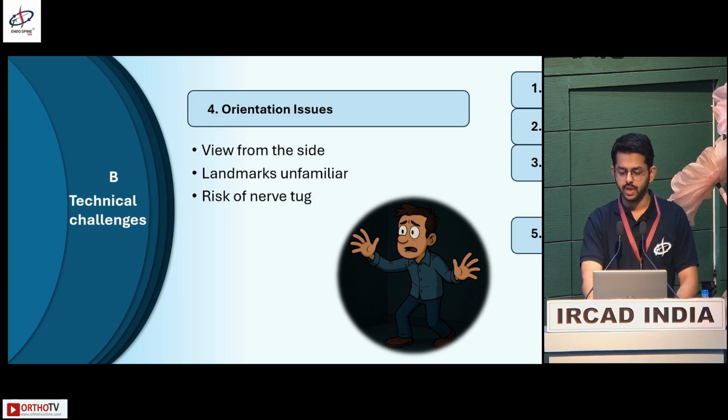Endoscopic views are magnified but distorted, especially in transforaminal cases where you are viewing anatomy from the side. It is easy to misjudge the depth or angles, especially when navigating around the root or fragments. This misjudgment can result in unintentional nerve root or dural traction. Surgeons must learn to mentally map the depth in 2D views.